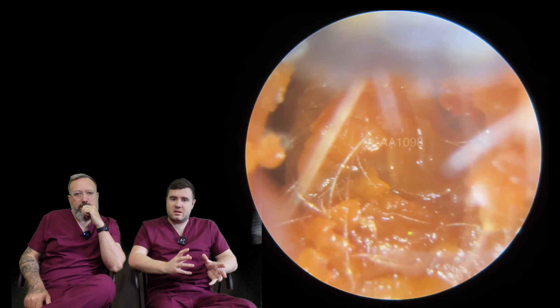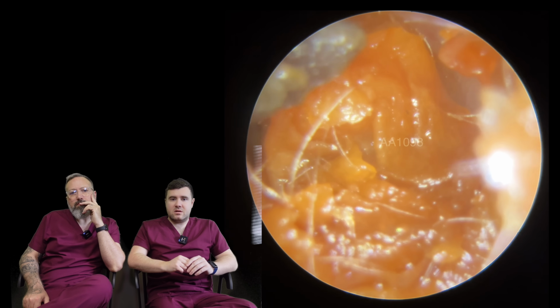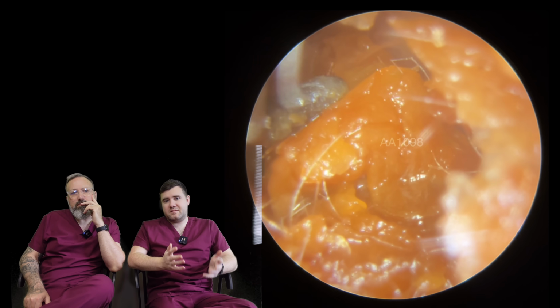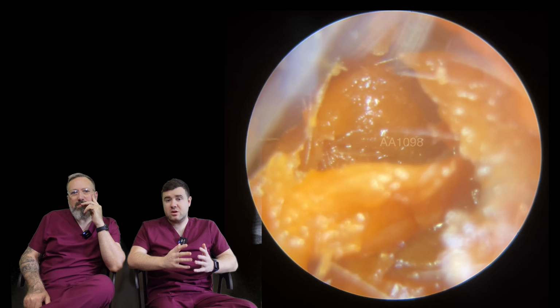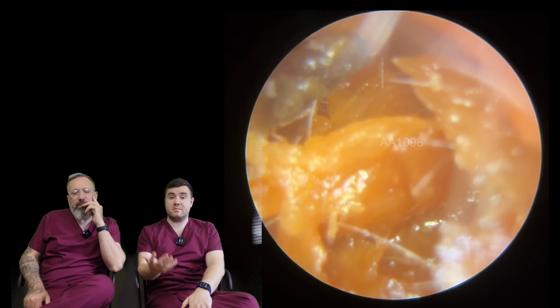But if someone comes in, there's gaps around the wax, you can see the eardrum, and there's quite nasty tinnitus, we do say to most patients that we have to use manual tools. But if there's wax right over the eardrum, we're not really going to be able to use curettage. We're not going to be able to use manual tools, just because of the safety side of it.